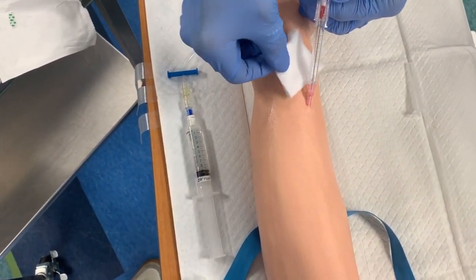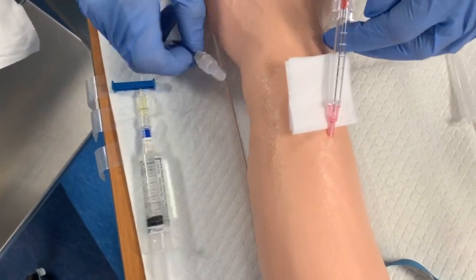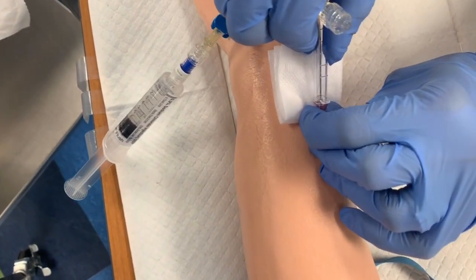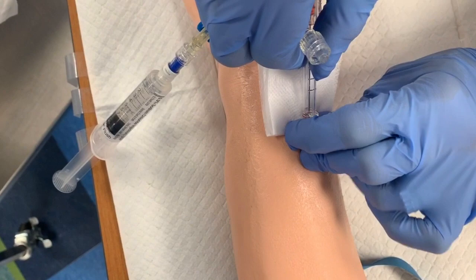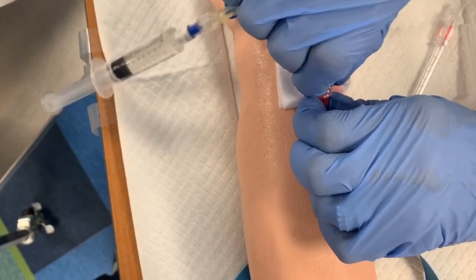Take your 2x2s and put it under your catheter, and that way when you disconnect your tubing, we're not going to have a lot of blood drawing and dropping there. So disconnect this. You always want to hold on to your catheter here. You don't ever want to let go of it. And if you press down with your index finger, your middle finger, press down as you come out, you're going to limit some of the blood that's going to back up.